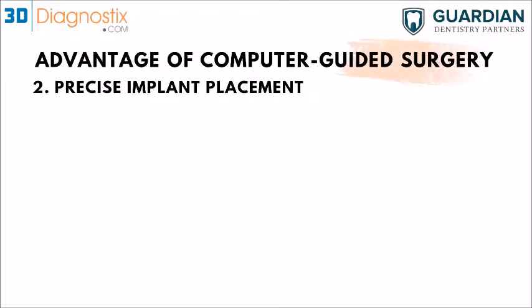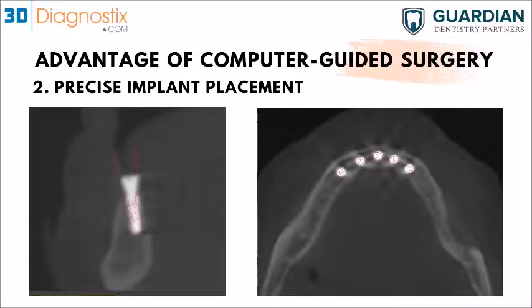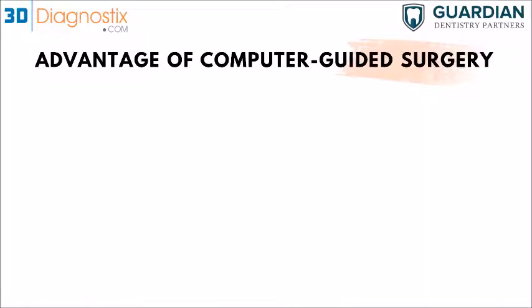So the second advantage is precise implant placement. Here, those are a couple of screenshots that we've taken. Those are post-op scans. And what we did is we overlaid the pre-op scans with the virtual implants in the planning software, and we stitched them together with the post-op. And as you can see through these screenshots, the red outline, which is the implant that we planned, is pretty much just lined up with the implant that ended up in the bone. So this is just an example of how computer-guided surgery helps a lot with accuracy and placing the implant in an anticipated position. So this is also one of the advantages of computer-guided surgery.